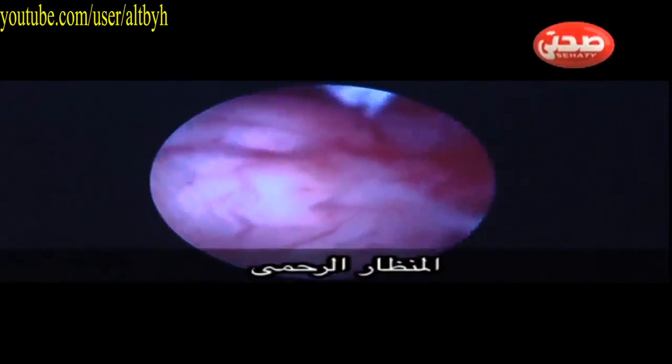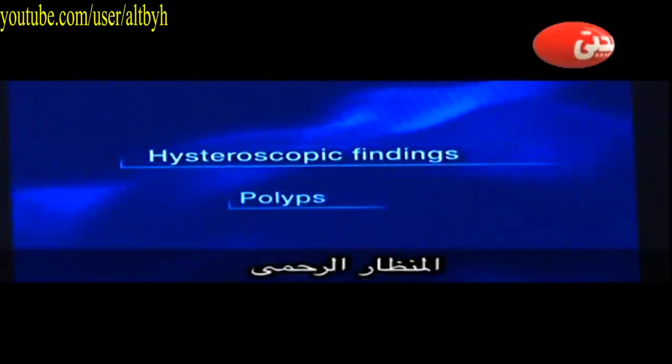The good or the important part of the hysteroscopy, it can also allow therapeutic treatment. So you can add the resectoscope and remove the myoma. For this case also, there's another submucous fibroid in this postmenopausal patient.